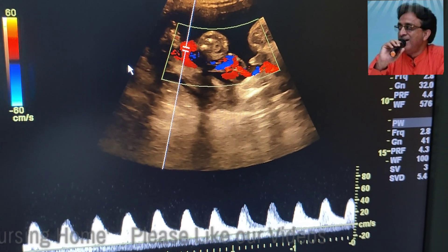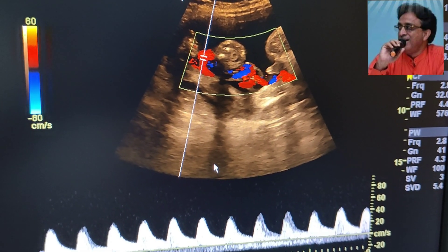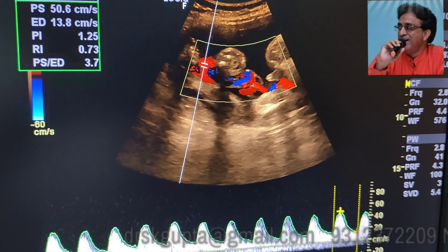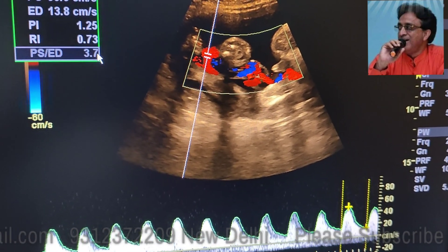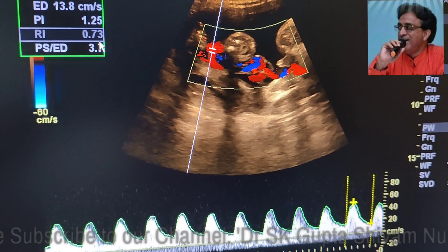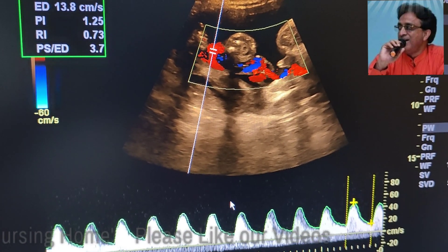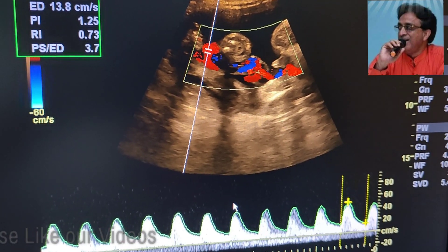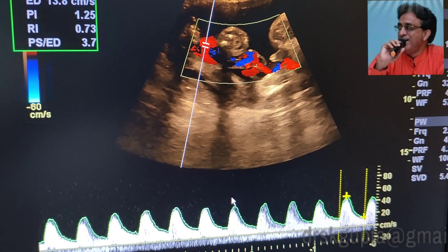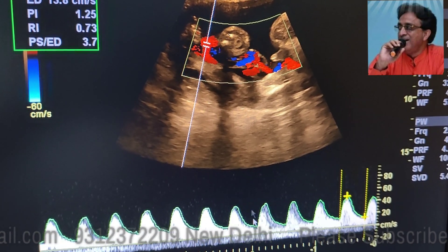Now let us measure the resistive index using color Doppler flow in the umbilical artery. We find that the umbilical artery flow shows a resistive pattern and the resistive index of the umbilical artery is 0.73 — usually the resistance index of the umbilical artery is 0.6. The PI is also 1.25, suggesting that there is resistance to the flow of blood into the umbilical arteries, confirming that the patient is having IUGR because of vascular reasons.